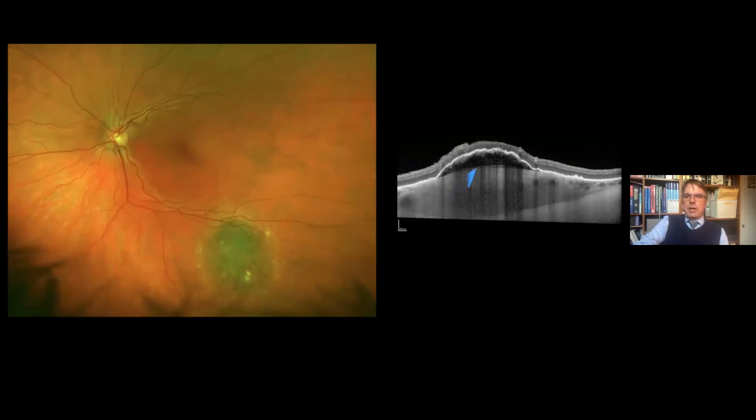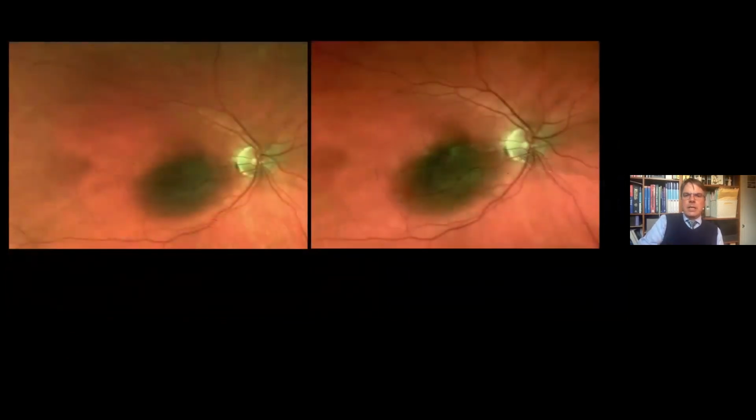And you can see that there, that cap of fluid over the tumor, that is one of the risk factors, pardon me, for malignant transformation. Doesn't mean it has to be a melanoma, but it's one of the 6 risk factors. And you can see it for changes over time. Again, this lesion, nobody can say, is this a melanoma or a nevus?